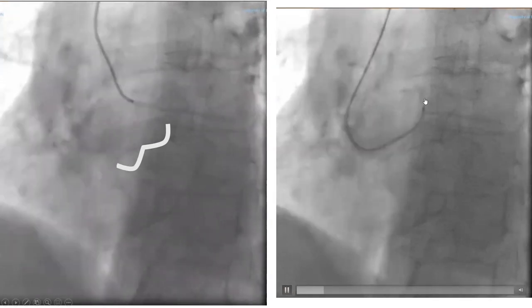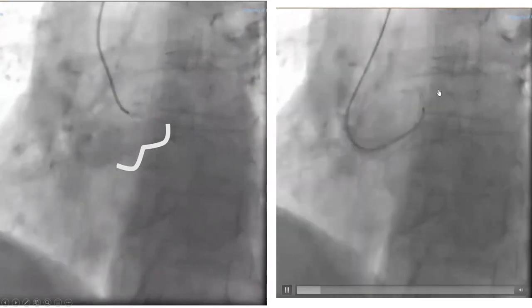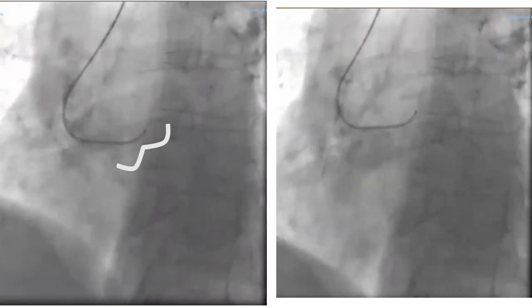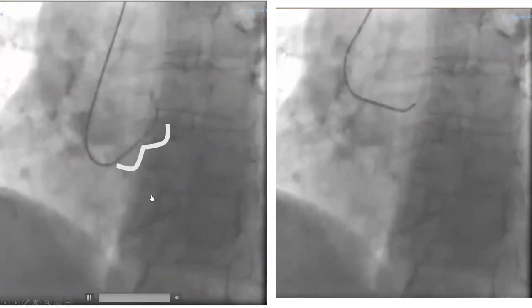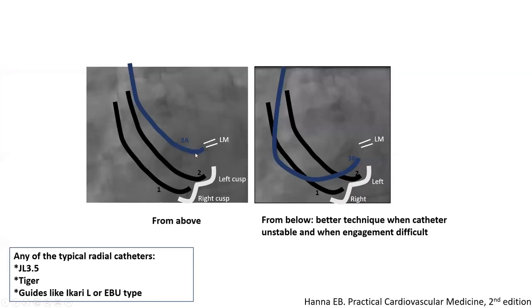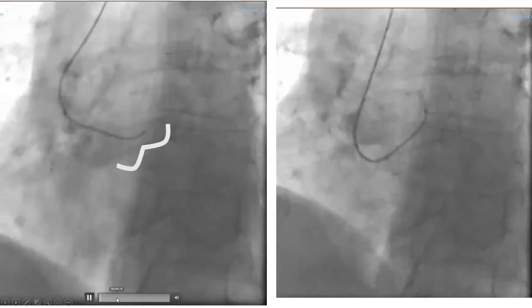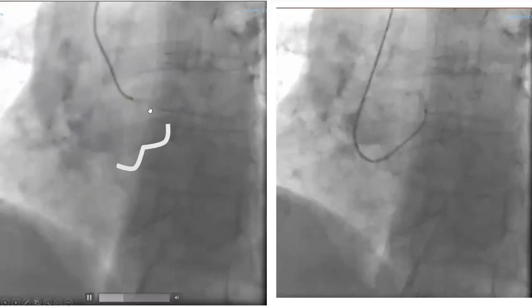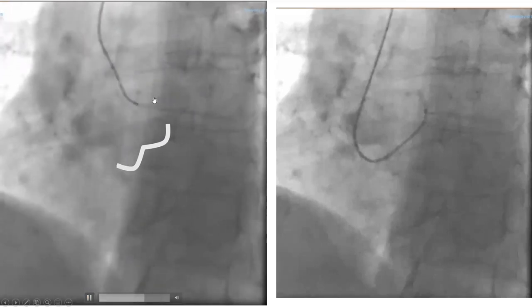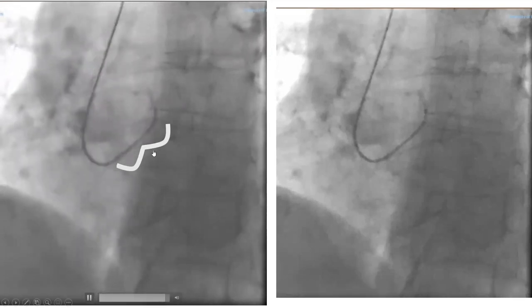Once you get in from below, you don't want it looking that way up — you pull it back to make it coaxial: for better images when you're coaxial, and for less risk of dissecting the ostium of the left main. A lot of times we combine above and from below. We tried from above, it didn't work or the catheter was about to fly out, so we decided to try from below. If it didn't work from below, you can go back and try again from above.